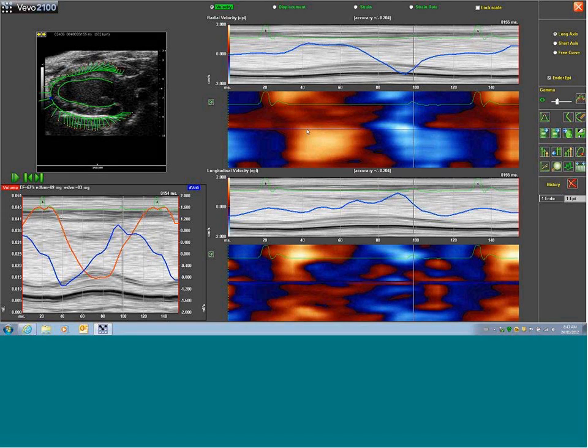This is a great question about getting sternum shadow in an image. There are ways to move around the sternum to acquire a better image without causing shadow. You can take the imaging platform and tilt it slightly down to the left, and put the transducer over the side of the chest, not right over top of the sternum.